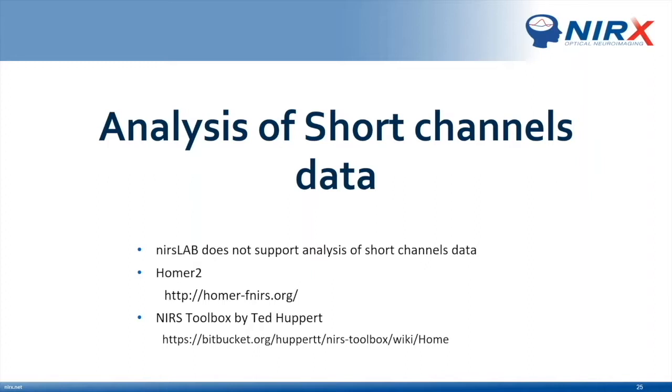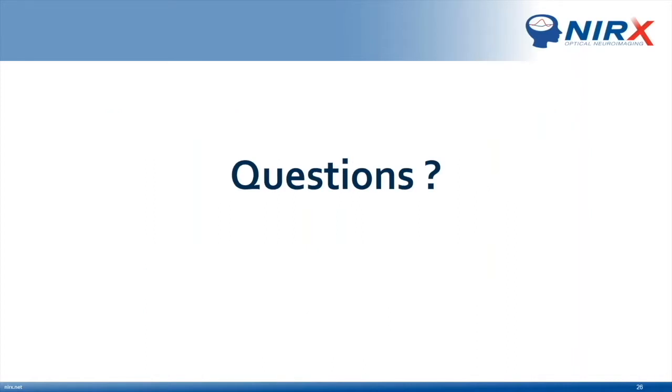You could look into forums. There are people discussing how to analyze short channel data, and in future, hopefully, we will be able to come up with some solutions regarding this. And this is the end of my webinar. We have a lot of time for questions.